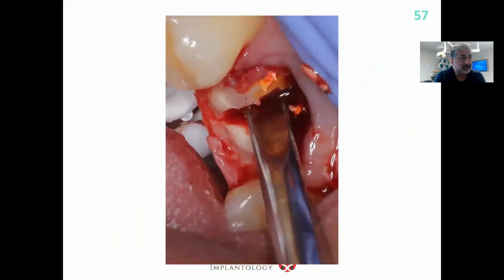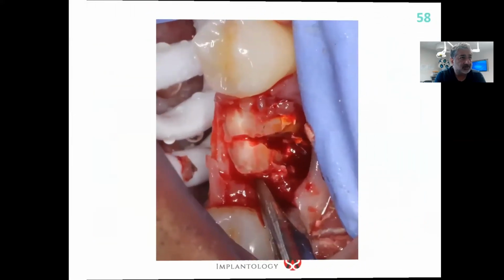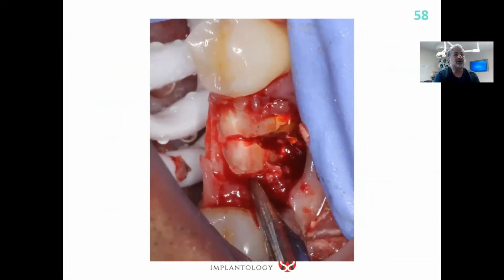And then I give a little twist with my luxator and you'll hear a little pop. Then I will go distally on the root and go right down the long axis and twist, and I will ask Alexa to count 90 seconds. In that time, cytokines are released and there'll be some deformation of the socket, and the tooth will become loose. We know those root canal treated teeth are buggers to take out. They'll just keep breaking and breaking, even to this day.